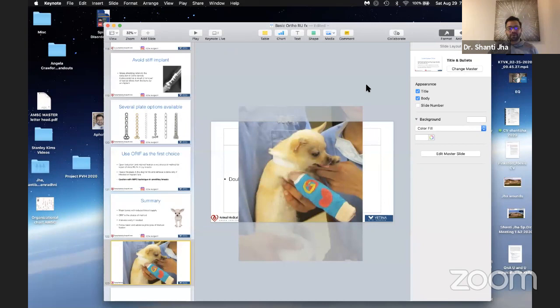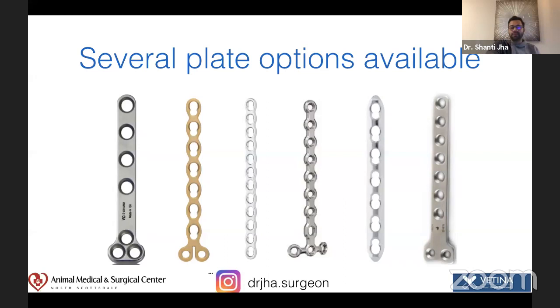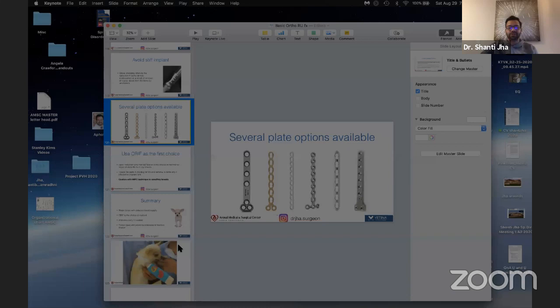For me, it's one of these plates you can use, but I like to use this gold system right there, which is a T-plate, notch T-plate. That's my methodology of using it. I'm not sure if it's available. Again, locking plate system is something you can use.